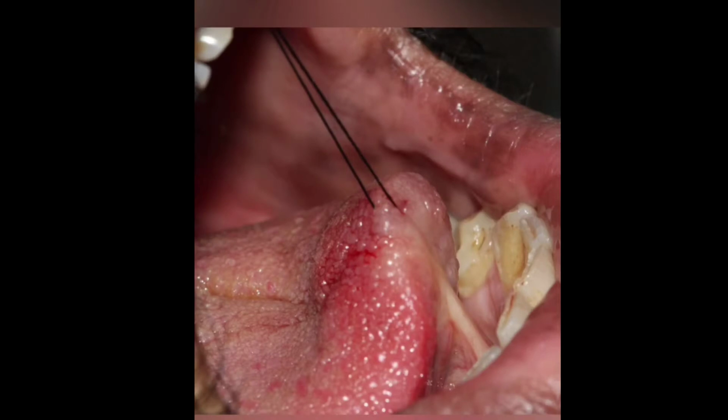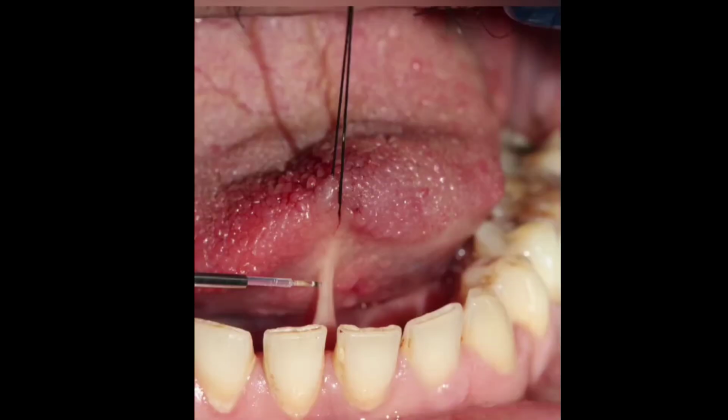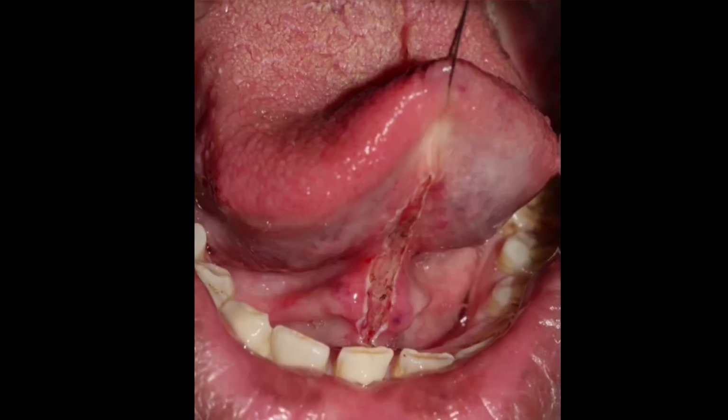After anesthetizing the lingual frenum locally, tongue traction was done with the help of a suture material. The diode laser beam was then applied lingually, both vertically and laterally to the frenum, to disrupt the mucosal continuity. No postoperative sutures were given.